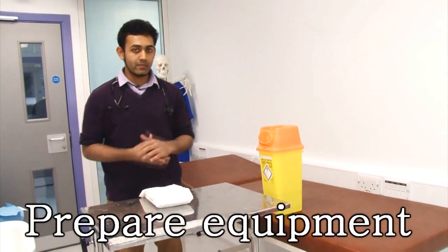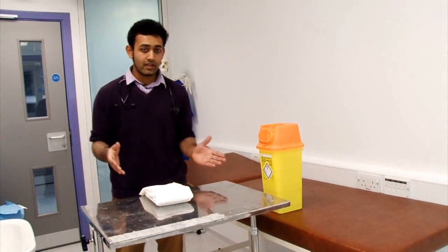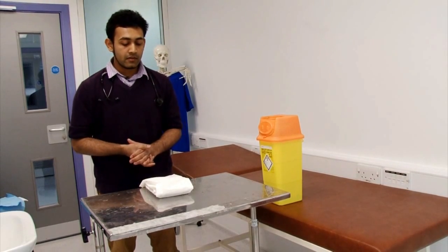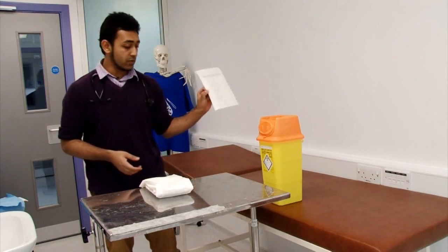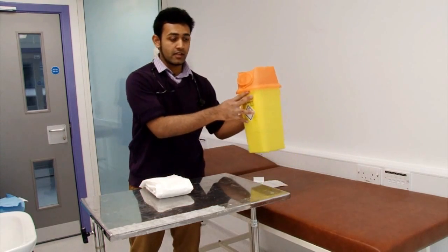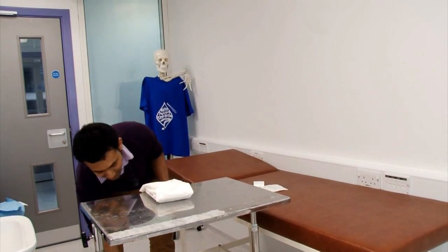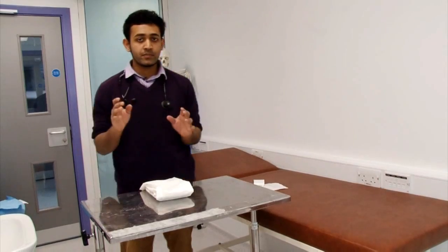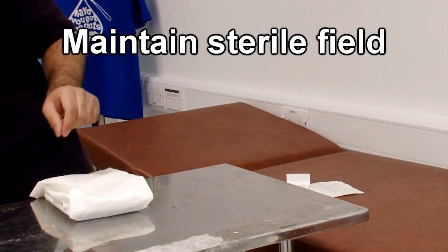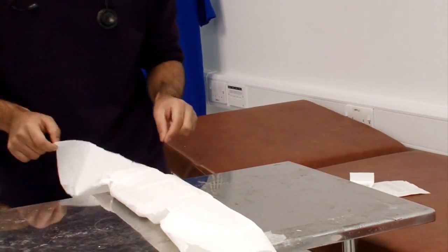Now we move on to getting our equipment ready before suturing the wound. Firstly, we need a sterile trolley — this will be provided in the examination. You'll have your suture pack here, some sterile unopened gloves, and some sutures. You should definitely have a sharps bin — make sure you put it on the floor somewhere nearby. At this point your hands are not sterile, so take extra care. Open the sterile suture pack with minimal contact as possible.